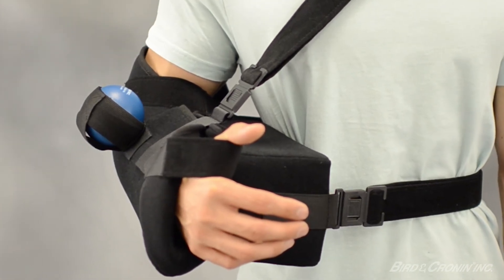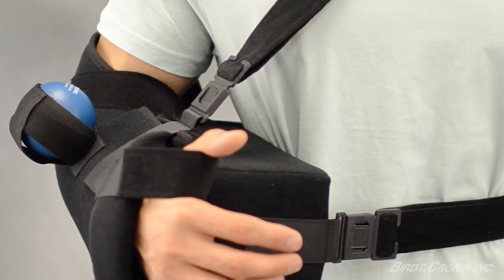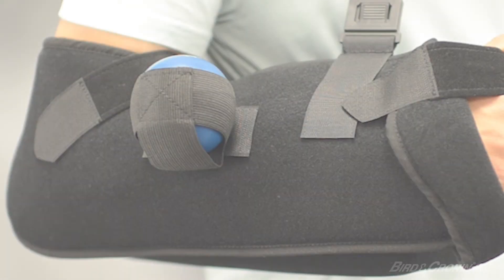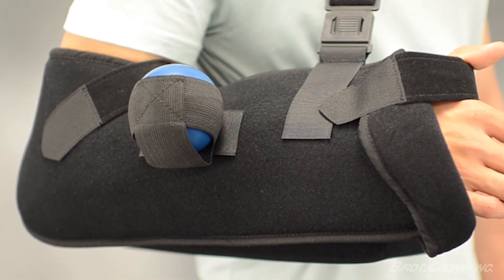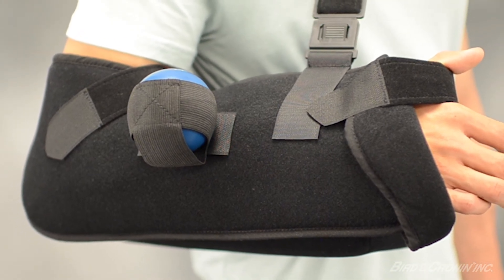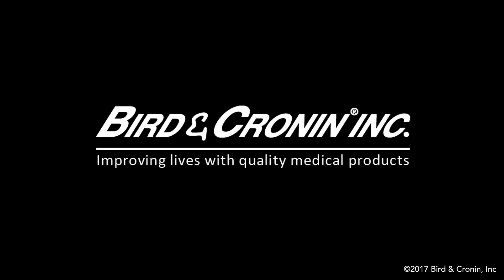An additional note: the waist straps on the abduction pillow and the shoulder strap on the arm sling may be shortened with scissors. If a patient is applying the product at home, it may be helpful to adjust their affected arm in the sling while resting the arm sling on a table or countertop. This concludes the demonstration for the application of the Super Sling Plus Universal.